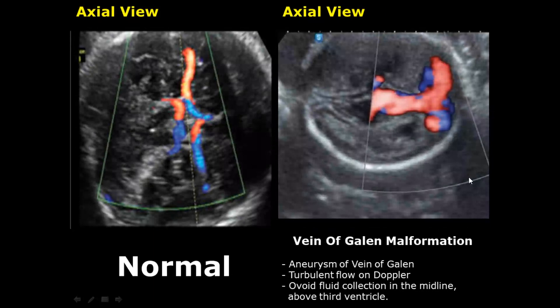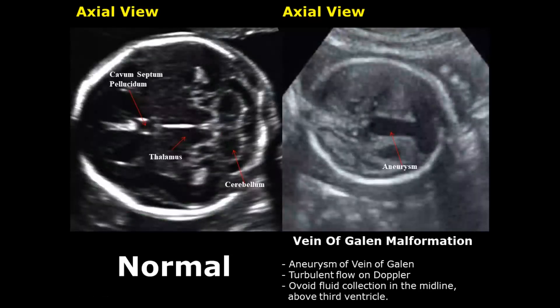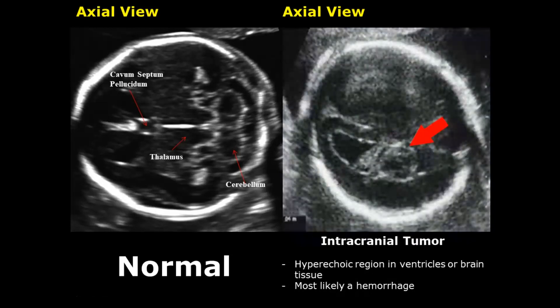In vein of Galen malformation, there is an aneurysm of this vein, and on Doppler it will show turbulent flow — a mixing of colors visible right here, with the vein having a larger diameter. Here is another image of vein of Galen malformation without Doppler showing the larger diameter, but the best way to identify it is on Doppler.